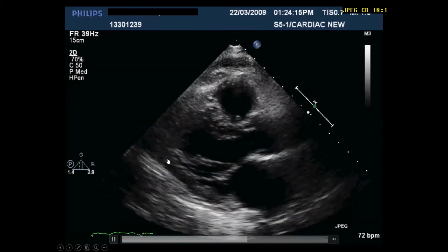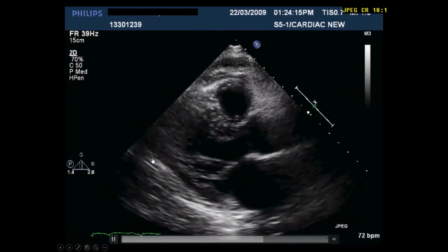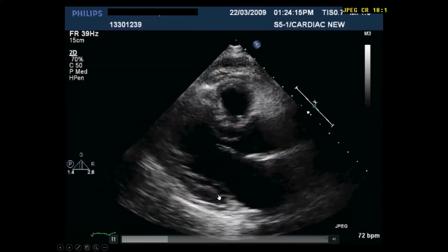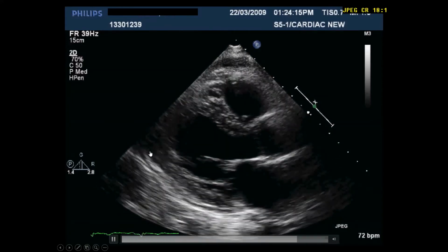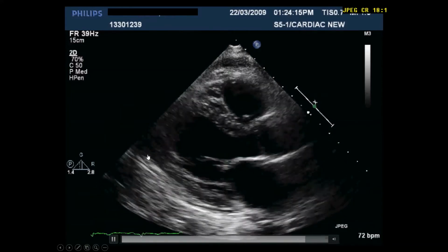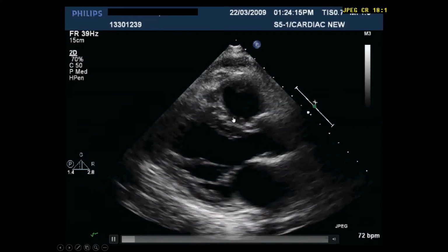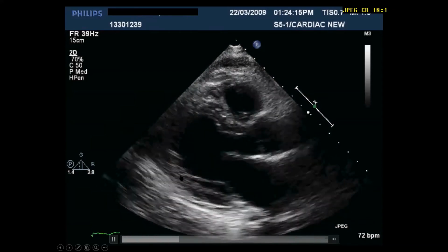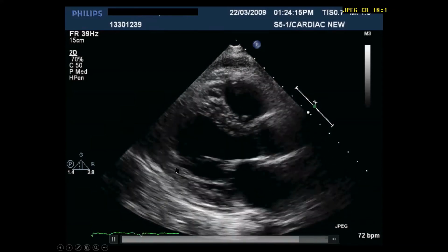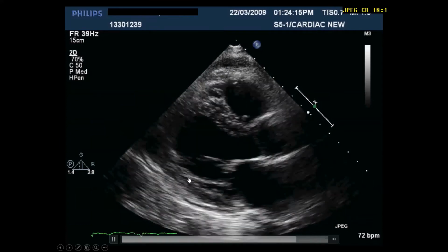Look at it. Is there any thickening in the posterior wall? Yes. Apart from the base, because the base moves with the cardiac skeleton, take it from here downward. Do you appreciate any thickening here? No thickening, akinetic. This is akinetic posterior wall.